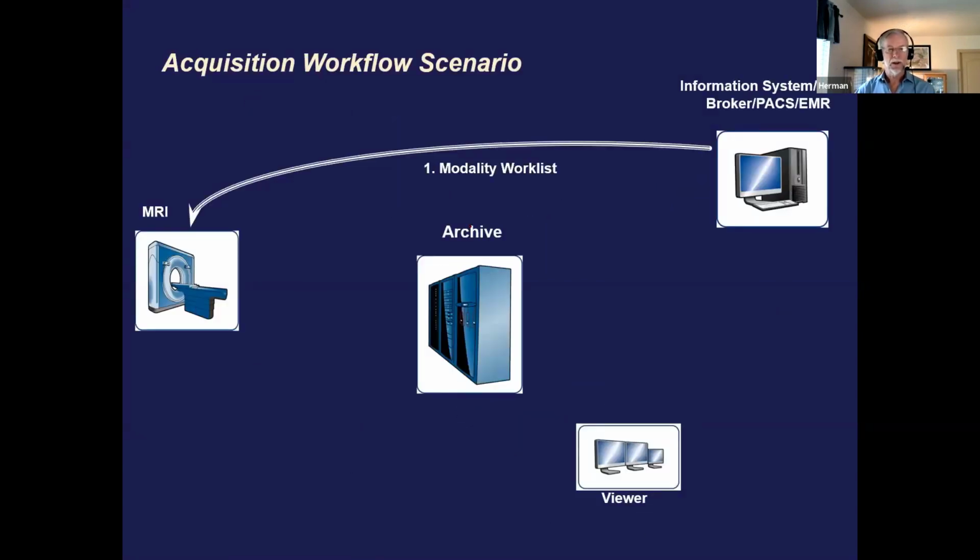So here's my worklist, right? So basically, how does it fit in the worklist? Typically there will be an order coming in if we have a worklist provider that is a separate box, or maybe in the PACS, or as a broker. But in some cases, actually, it could be in the EMR. The worklist could also be in the EMR, and actually I see that increasingly happening. A lot of hospitals are rolling out, or have been rolling out, EMR implementations, Epic, Cerner, and so on. And so they now also provide worklist capability.